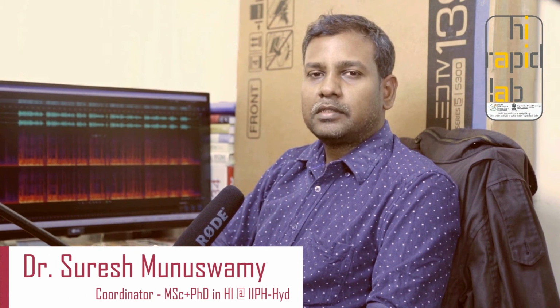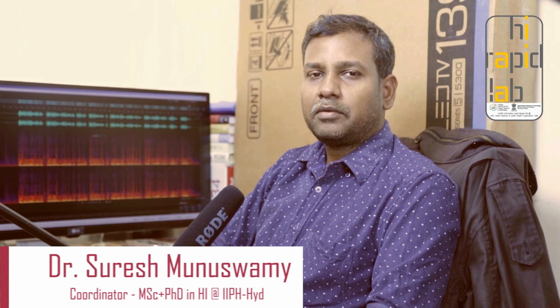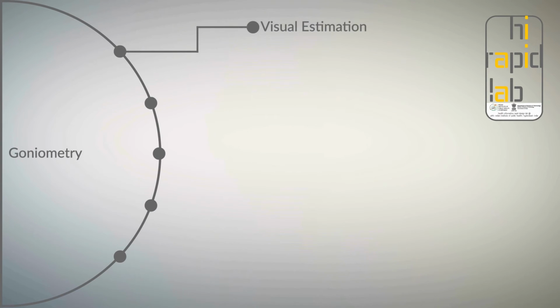What are the types of goniometry? As mentioned previously in this episode, the process of assessment using a goniometer is known as goniometry. As of now, there are several goniometric techniques. As technology advances and more applications emerge, several new concepts of goniometry have been proposed. Let us try to understand them one by one. First technique is visual estimation. See and measure with eyes. Simple. Second technique is technical. Uses a standard mechanical universal goniometer placed across the joint to measure. Currently, this is also the universal gold standard.